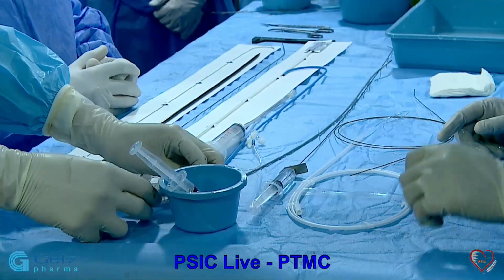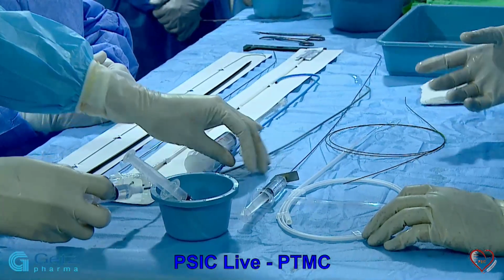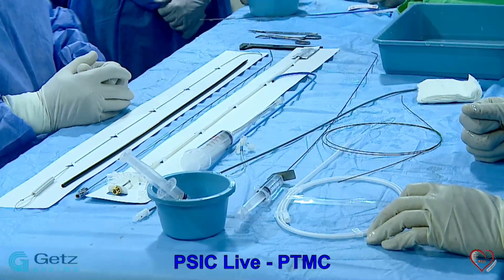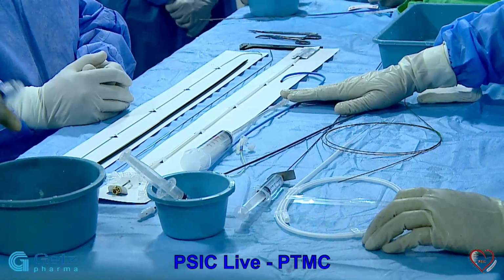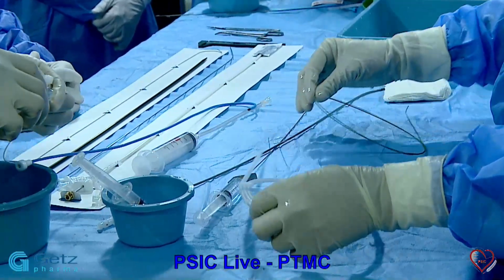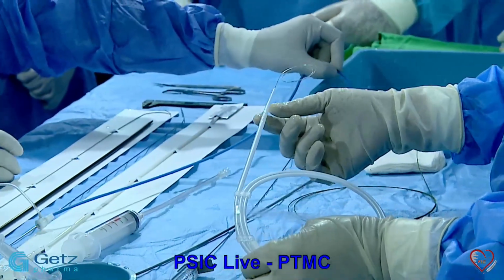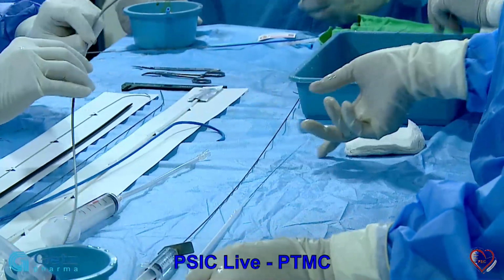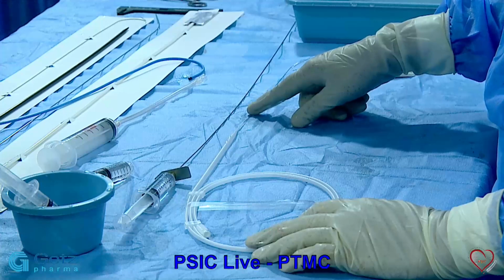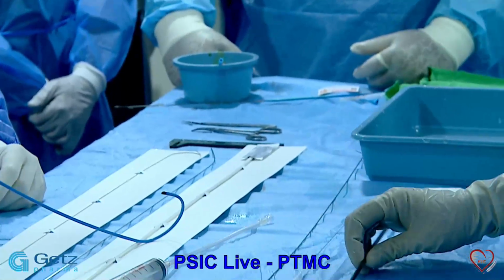For septal puncture, we will have some slides so that before the procedure we can give our fellows an idea of what we are looking for when we are puncturing the septum. Once we have punctured the septum, then comes the role of this PTMC wire, a pigtail shape PTMC wire. This is a softer wire that will reside inside the LA, and the whole system will go on this wire. Once the wire is there, the next step will be the dilatation of the septum.